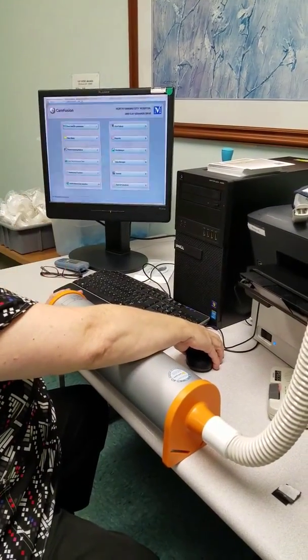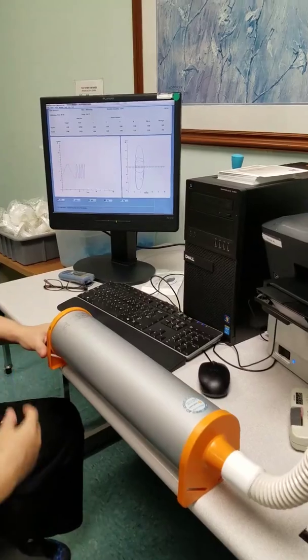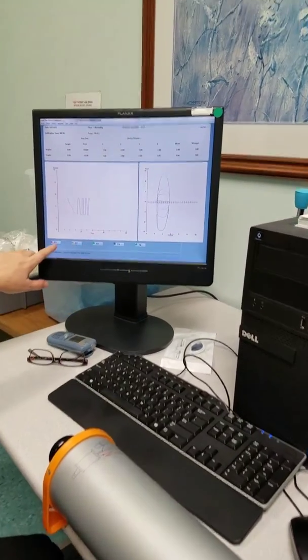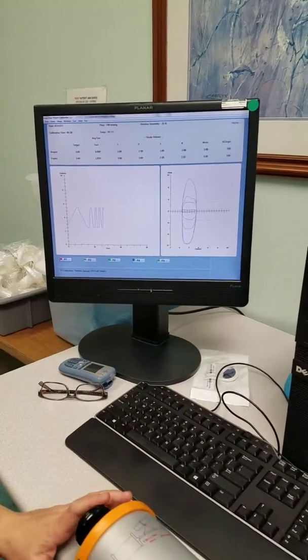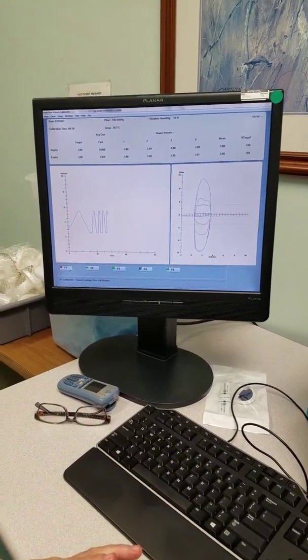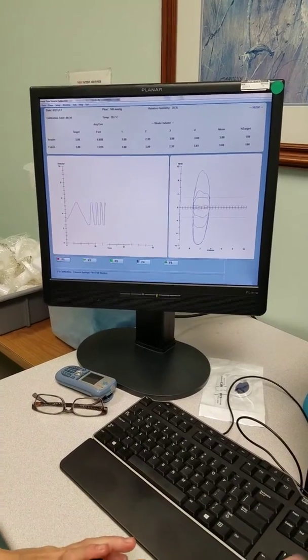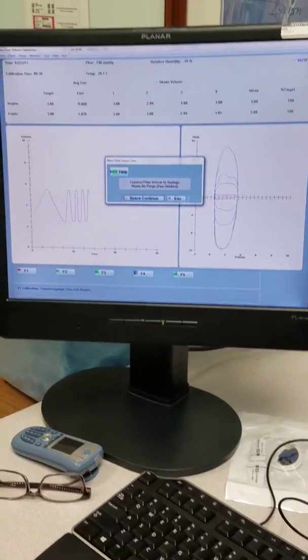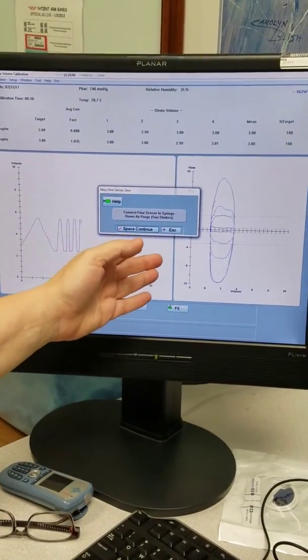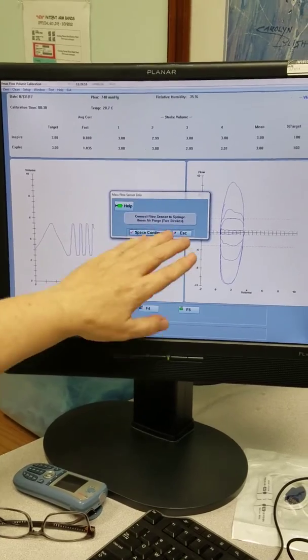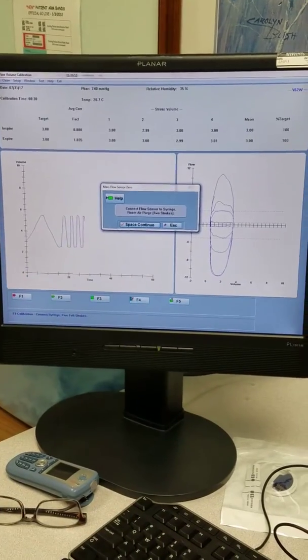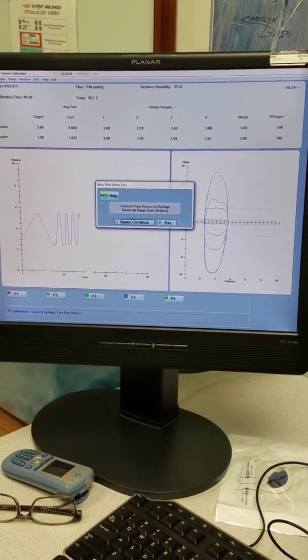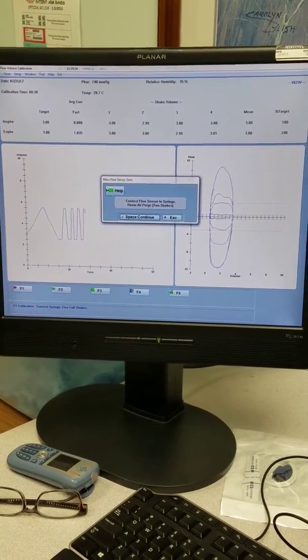You go to the flow sensor calibration page. F1 you're going to hit to start and the machine's going to immediately tell you what to do. That message will come up. It wants you to flush it with two syringe strokes. So that's what we're going to do.